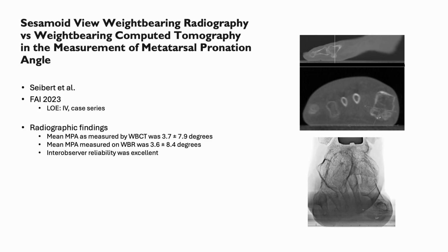My take on this, and why I think our paper really helped us, is that we know x-rays fool us sometimes, and if the x-ray tech positions the foot just a little bit off, if there's not a clear image, do you get that full detail? Do you get the arthritic findings? Do you get the cystic changes? Do you get to actually see if there is a crista? So it would be nice to say, hey, let's correlate our study with this type of study and see if we find the same things.